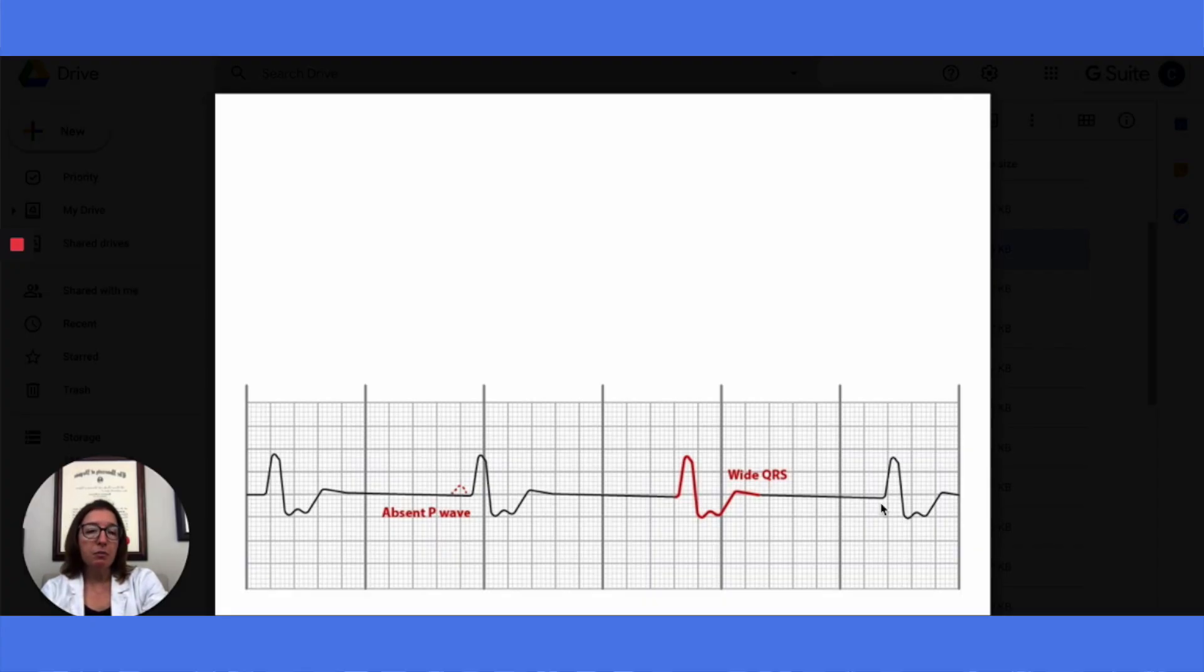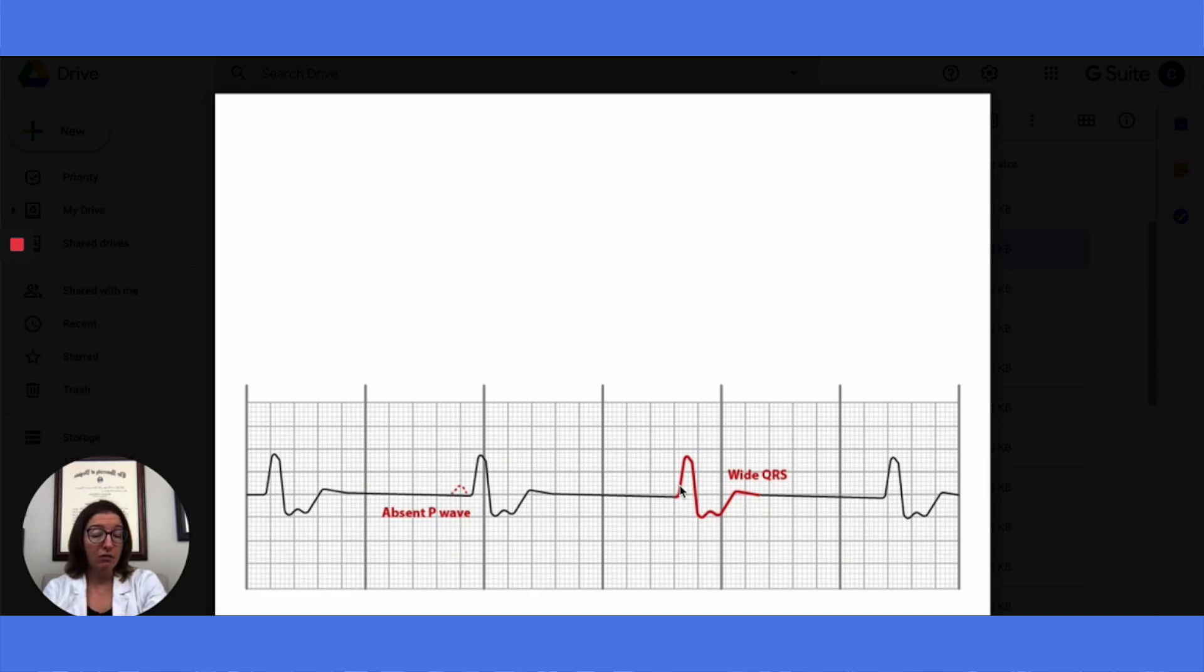It is possible to have an accelerated ventricular rhythm, which would have a heart rate that would be over 40. But for a normal idioventricular rhythm, we would expect a heart rate under 40. In terms of treatment, idioventricular rhythms are typically transient and often don't require treatment at all.